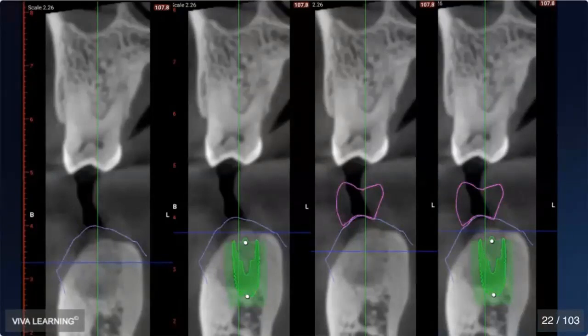The patient would be upset. They would have a restoration that's too far lingual. Their tongue would play with it. It would be a failed case. And we would have gotten to this failed case with a CBCT and an intraoral scan overlaid. So even with a good diagnostic image, we're still not having enough information to do a really good job.